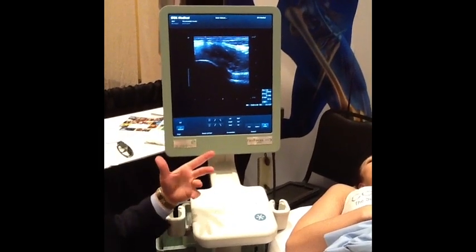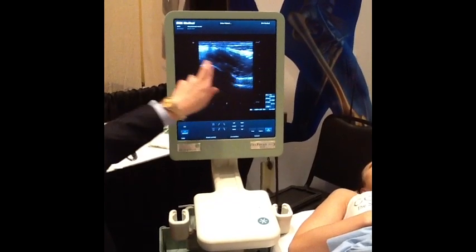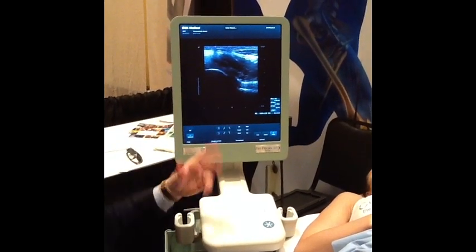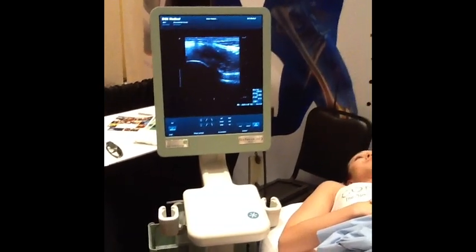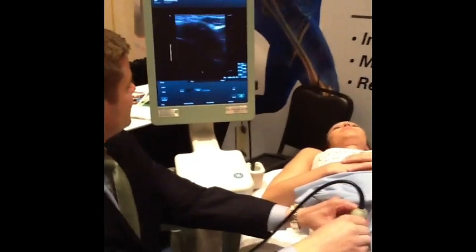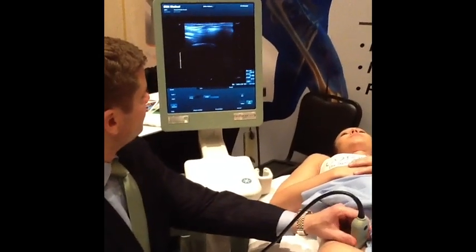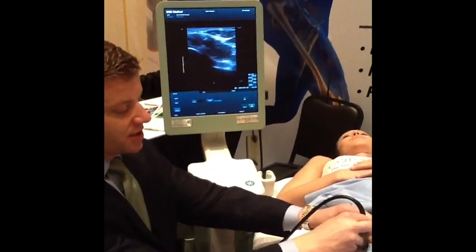You've got a lot of flexibility of where you actually drop the needle. Your needle can go anywhere in this area and it will flow intraarticular. If you had contrast and then snapped a picture with your fluoroscopy, you would see it flow into the joint. So the next step would be, once we get this image, you need to think about how you're going to inject.